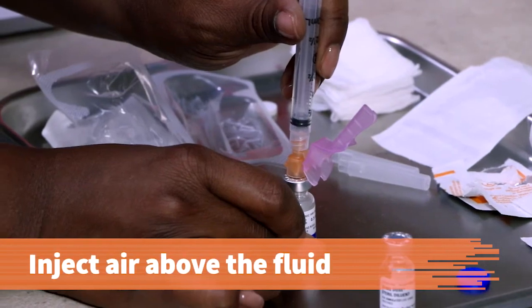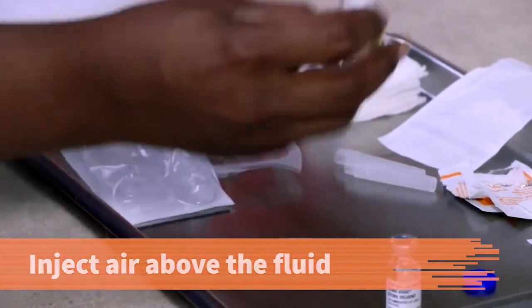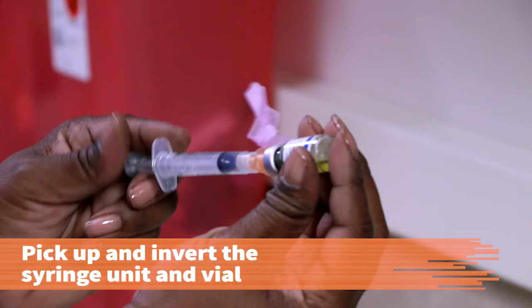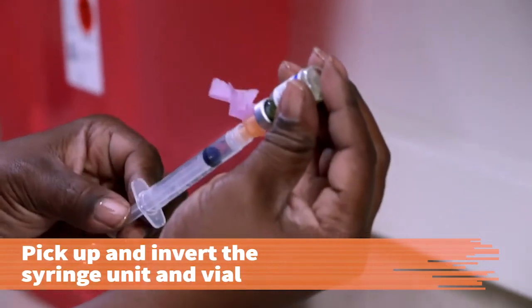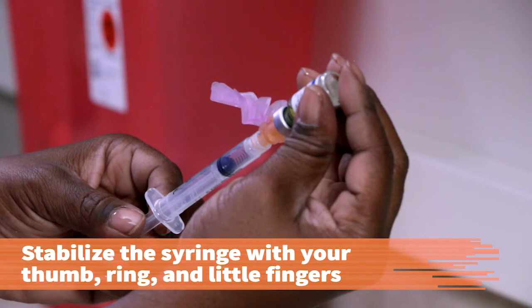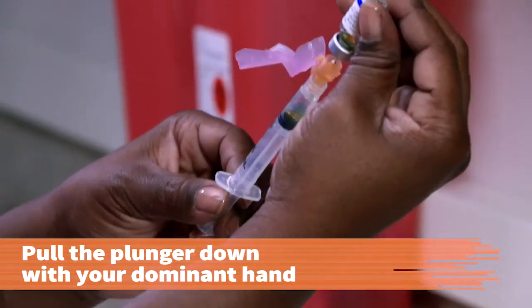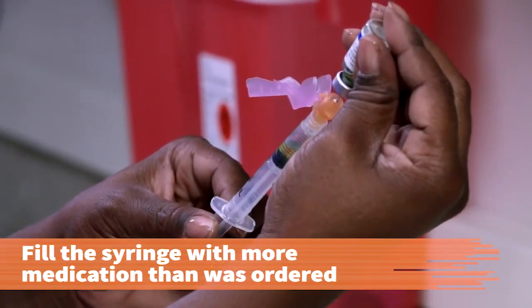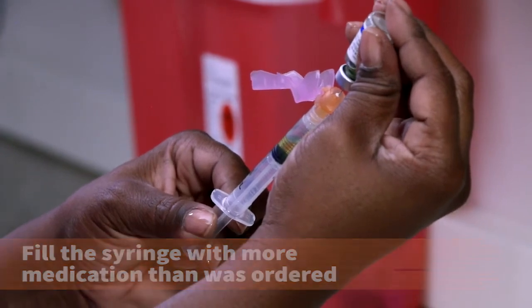Inject the aspirated air above the fluid in the vial. With the palm of your non-dominant hand facing upward, grasp the vial between your middle and index fingers. Keeping the syringe unit in the vial, pick up and invert them. Use your thumb, ring, and little fingers of your non-dominant hand to stabilize the syringe in the vial. With the syringe at eye level, pull the plunger down using your dominant hand. Fill the syringe with more medication than what was ordered.